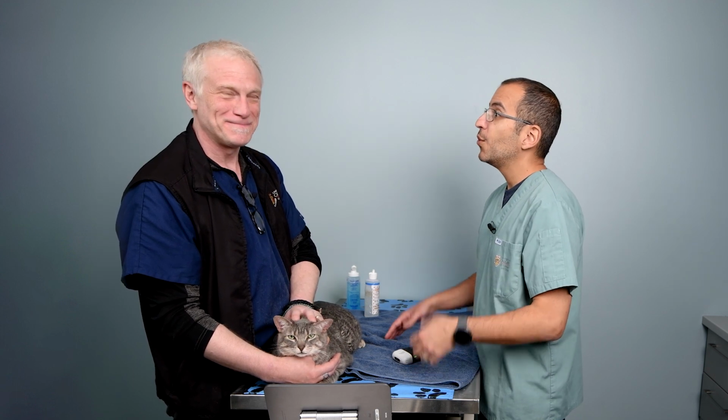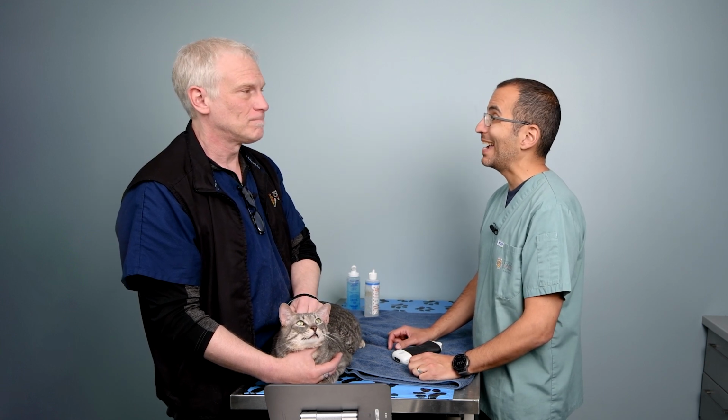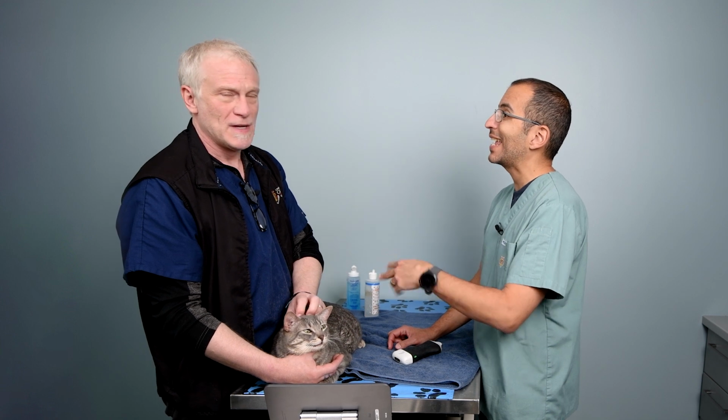Okay, so now, like we said, we're going to be talking about the different pathologies that we can find using pleural space and lung ultrasound. We've already talked about pneumothorax. Now let's talk about alveolar interstitial syndrome, AIS. What are the top two things you're going to be looking at when we're looking at the lung surface?